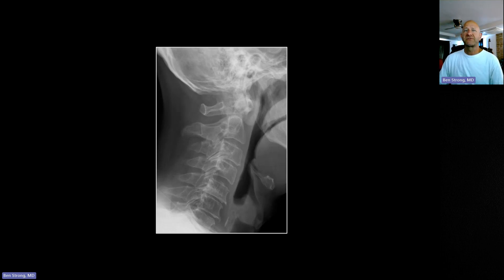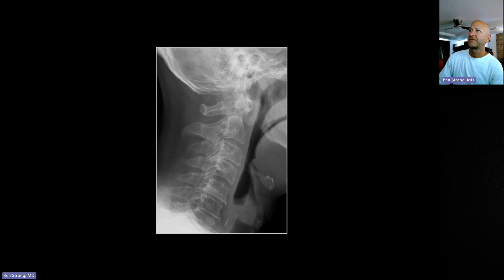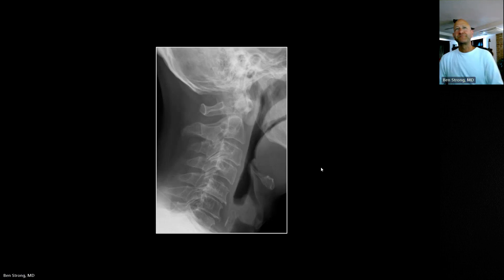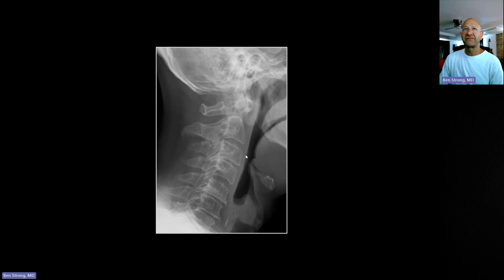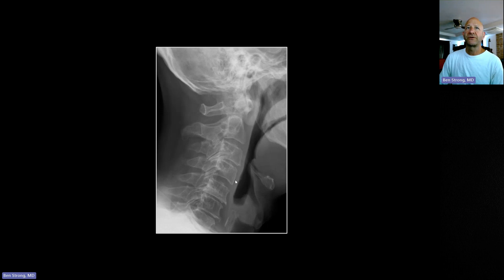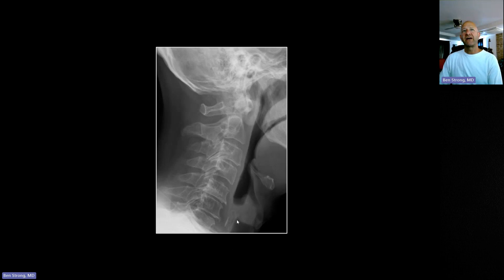We're looking at a lateral cervical spine here, and for the benefit of the first years, I'll quickly run down the lines that you evaluate on any given cervical spine. When you look at a lateral C-spine, you want to pick out four specific lines. You want to look at the soft tissues — the prevertebral soft tissues. The rule is that the width of the soft tissues above C5 should be less than one-third the width of a vertebral body. At C5 you come into the glottis, so you'll see the soft tissues bulge outward, and from C5 and below you want to see the soft tissues be less than the width of an entire vertebral body.